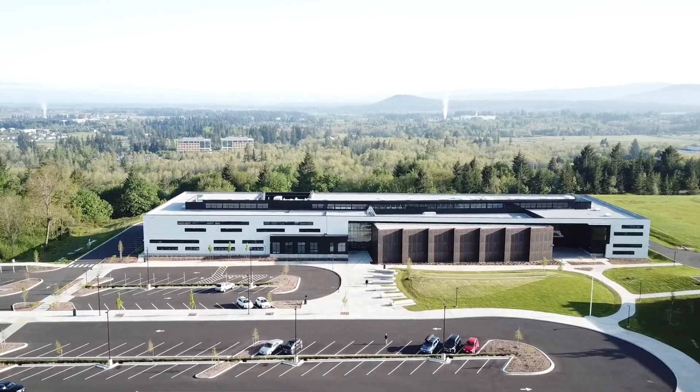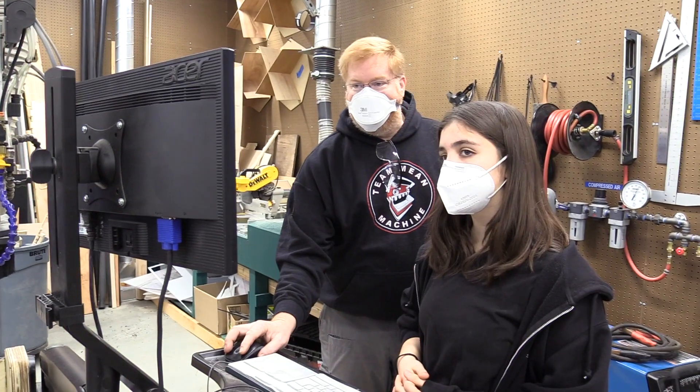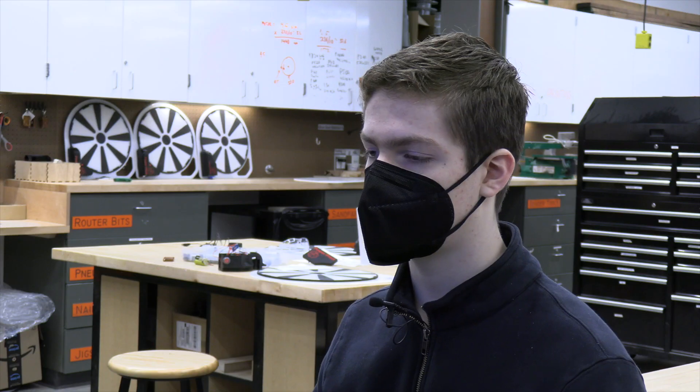Most of the power pivot was made at Discovery High School, which is a project-based learning campus. Both the base and rotating disc were made on a CNC router. The Teflon slip disc and the grip tape were made on a laser cutter. The housing and gear segments were made on a 3D printer. We have custom gears made out of steel, and we order electronics and motors.